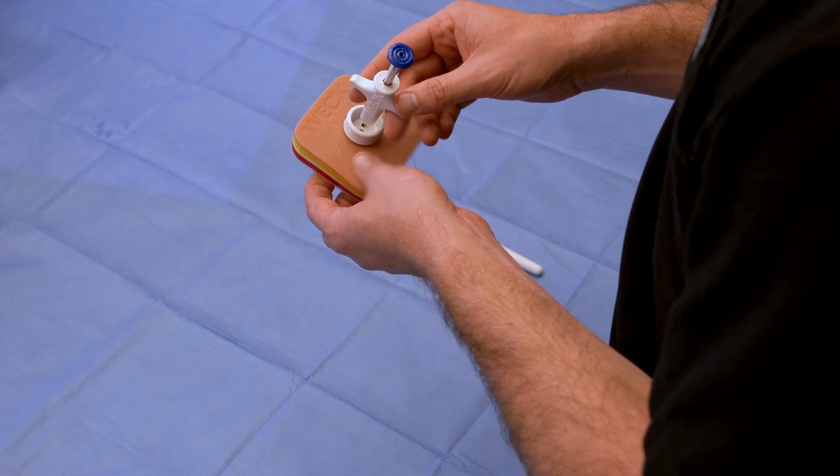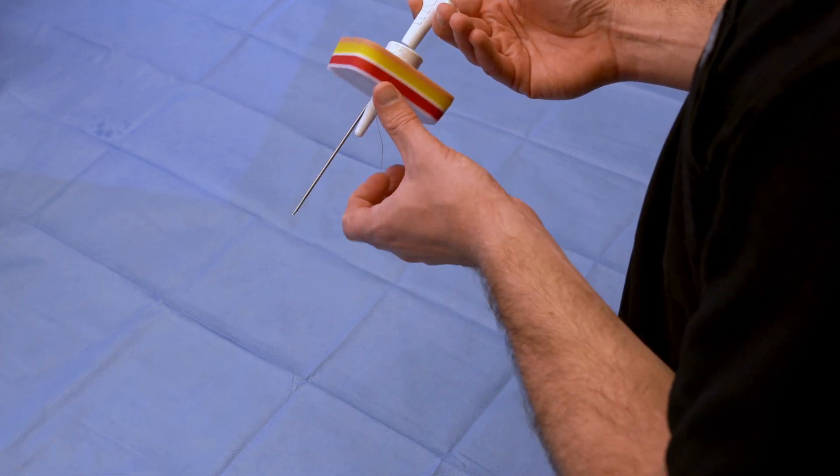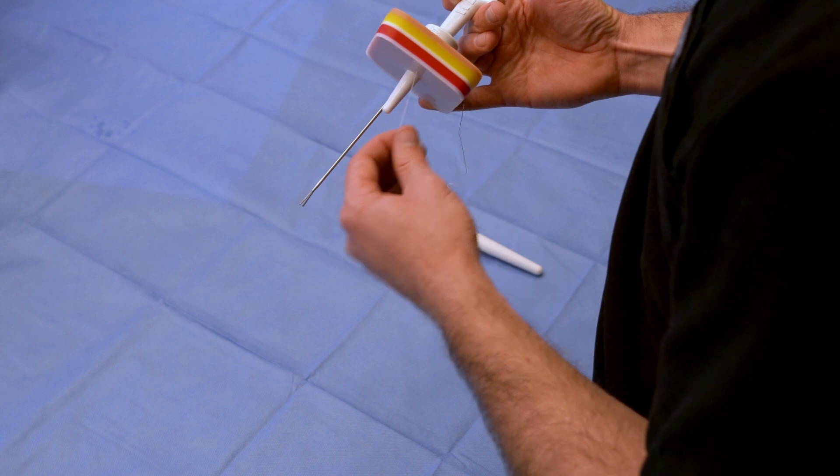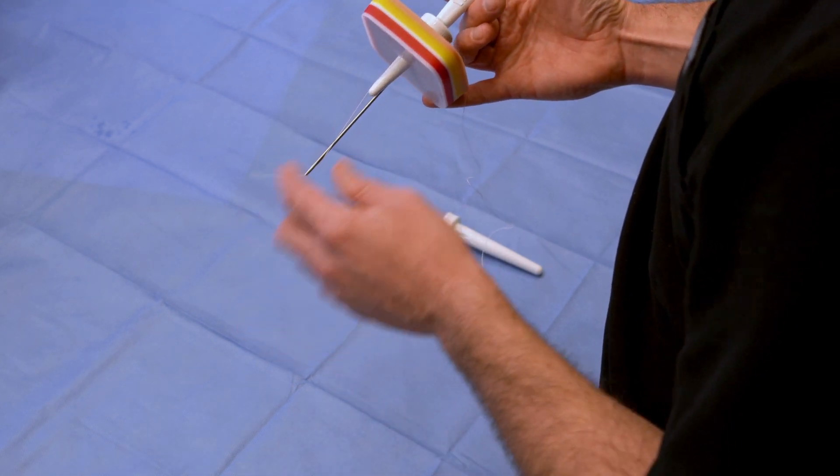Once the passer tip is through the soft tissue, press the button to open the jaws. Release the button to grasp the end of the suture.